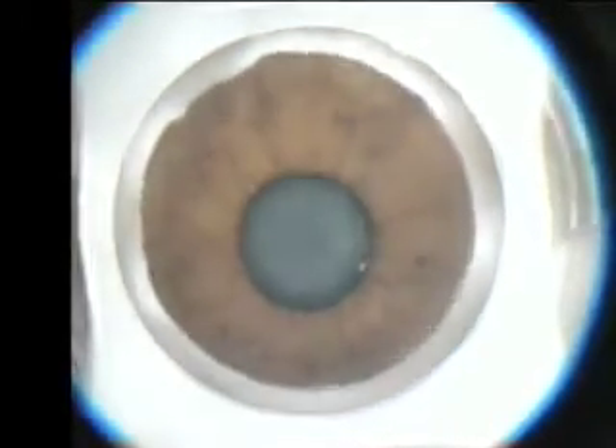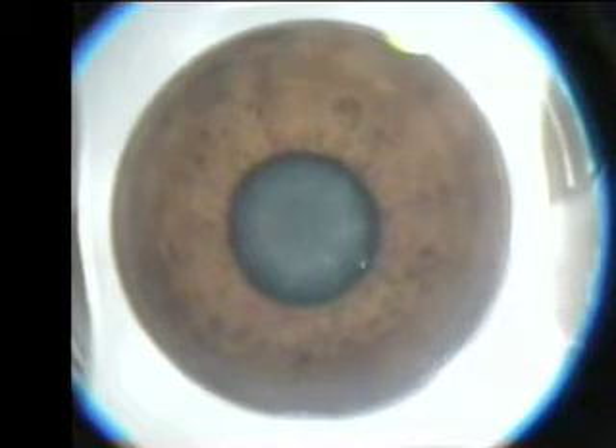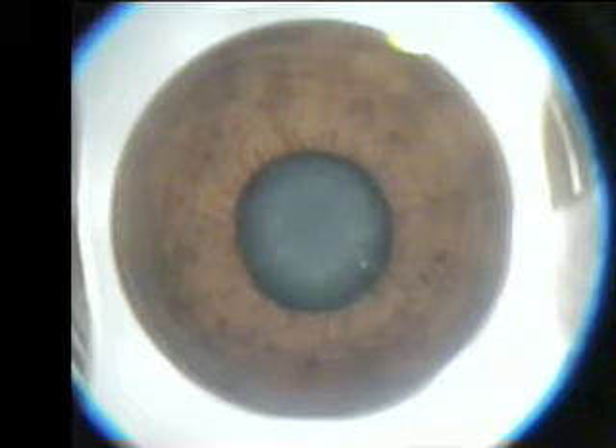In the left eye, a standard hyperopic correction with the same modalities. Here we're seeing the IntraLase application of the cornea. We're going to try and slightly de-center our IntraLase corneal flap nasally, as we will see later on, our ablation will be guided by topography over the visual axis and not the pupillary center. We're seeing here the IntraLase creating our corneal flap — 17 seconds — the peripheral cut here. This is a superiorly hinged LASIK flap.